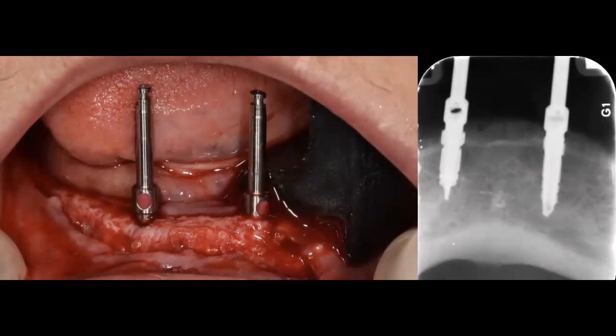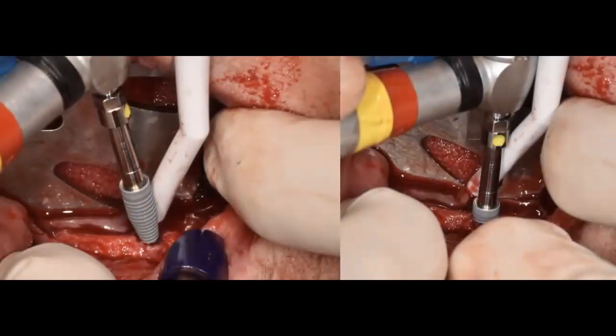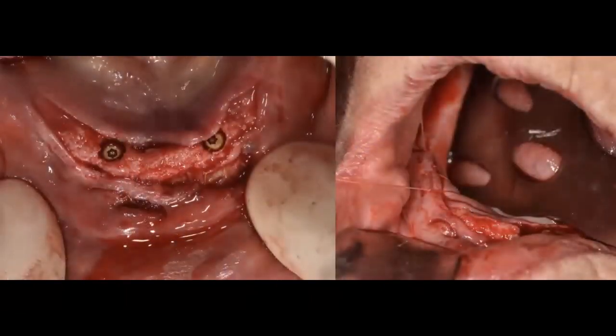You see that we're taking all these photos to make sure that these drills are nice and parallel, that they were within bone. And now we go ahead and place our fixtures. We're going to place 2 implants, 2 Nobel implants, one on each side. And then we're going to go ahead and take some x-rays and suture. You can see the really good location of the implants where we wanted them.